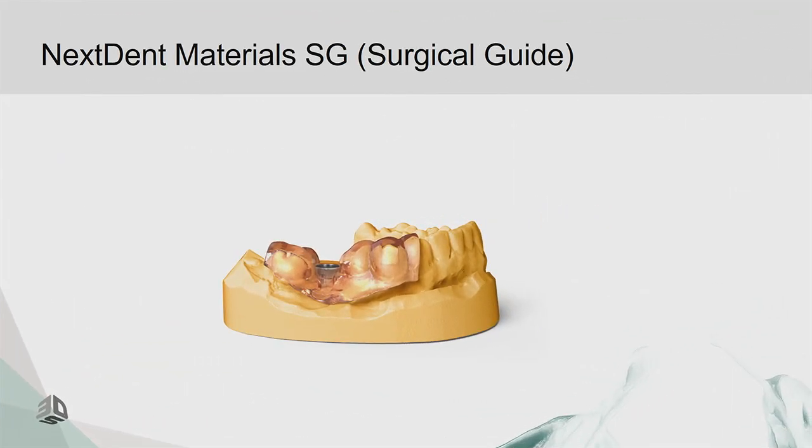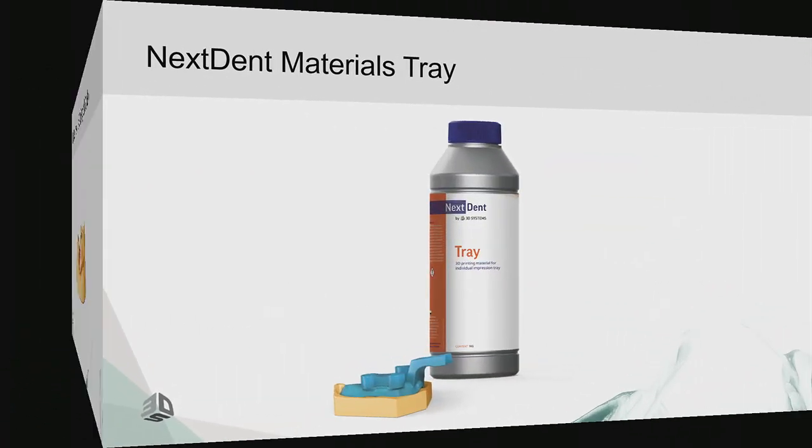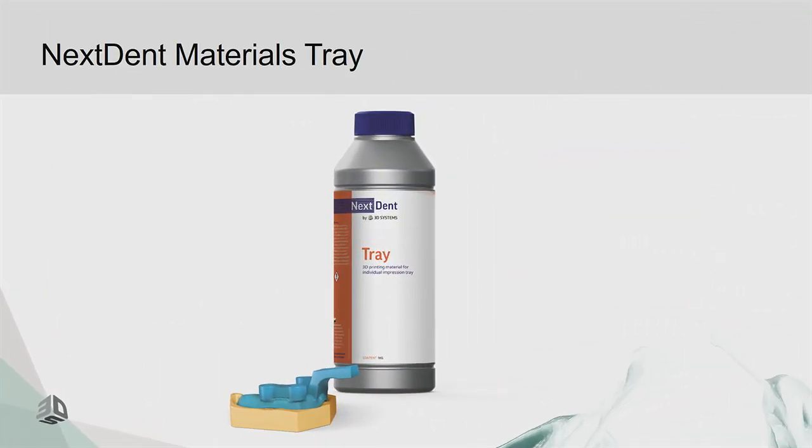You can see that in this picture we inserted the sleeve. We advise you to insert the sleeve before post-curing. The material is in what we call its green state. It's slightly flexible. Therefore, the sleeve will fit perfectly into the part after post-curing. It's locked and ready to use. So now this is the right picture for the right material.